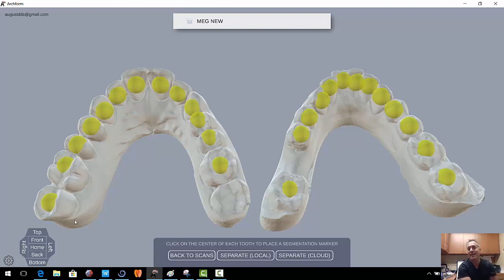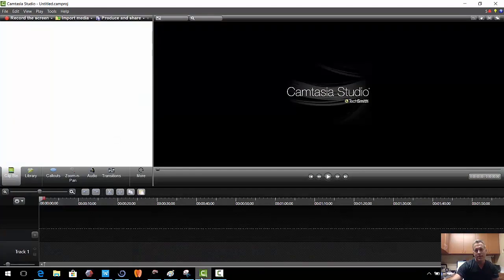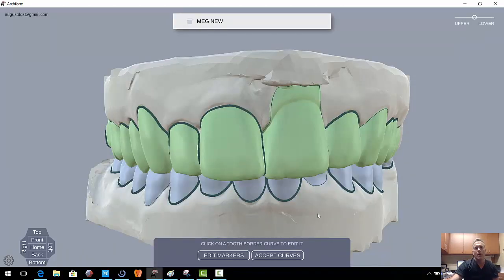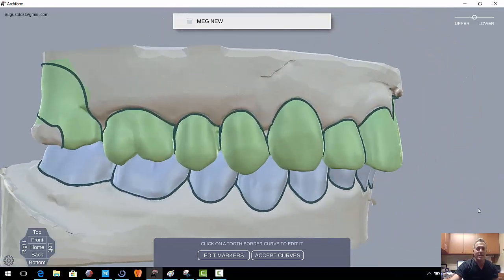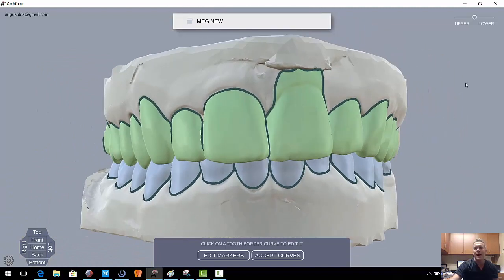Now, if you have a very fast computer, you can go ahead and do it on your computer. My computer is kind of fast, but not that fast, so we can take advantage of their big supercomputers, and we can click on Separate Cloud. This is going to take about 5 minutes, so I'm going to go ahead and pause this. Okay, so you can see the computer did a pretty good job of isolating a number of the teeth, except for maybe 2. So we're going to go ahead and correct that.